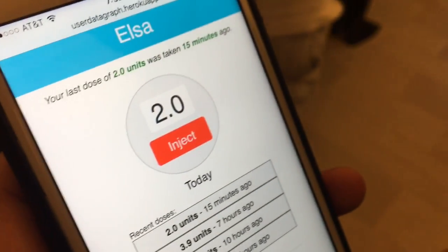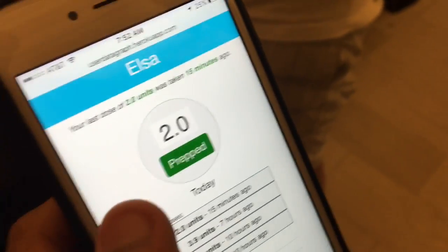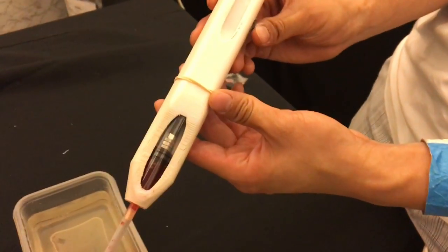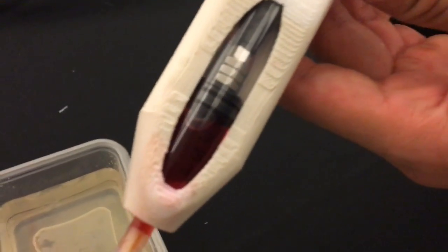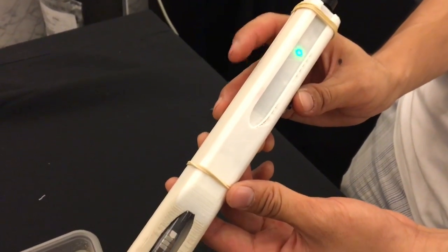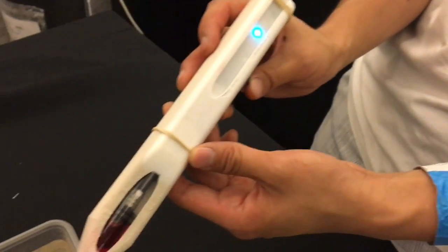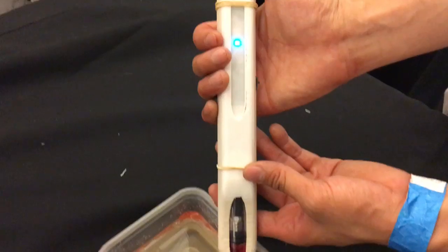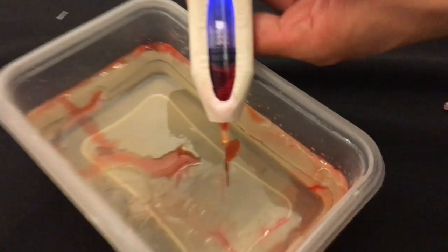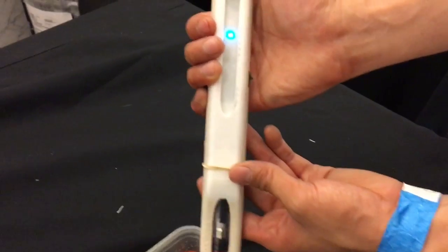And so we've suggested that the patient take 2 units of insulin, so the patient can tap inject, and that preps the pen, and so you see it turn green. And now what the patient can do is they can take this pen, and you can see it's filled with insulin, and they press a button, and once they press the button, they can start injecting. And so we'll show that now. Pressing the button.